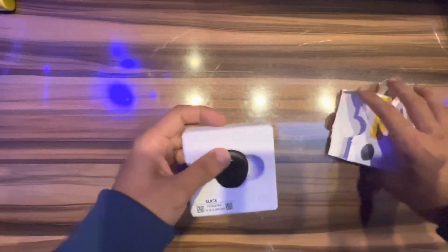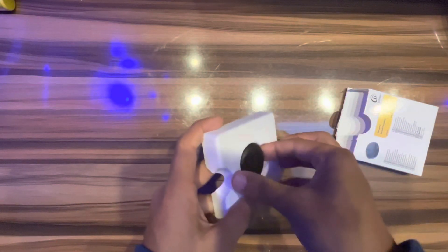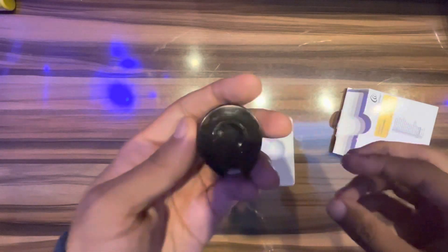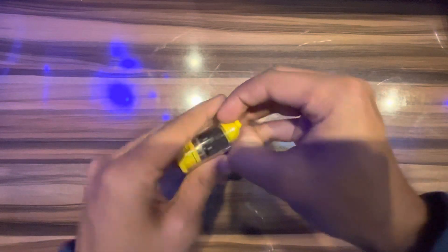It is black in color. The yellow light is for the second program. This is magnet number five — I will fix this magnet into the Kanso 2 sound processor.